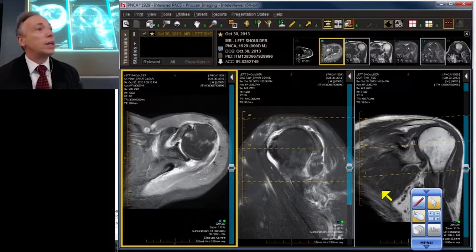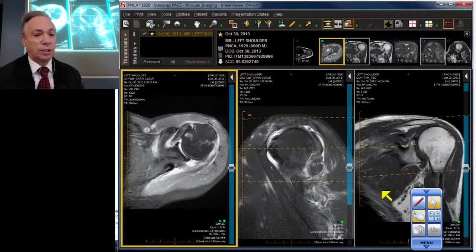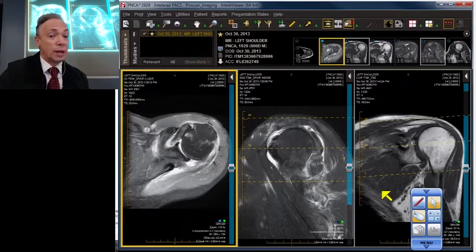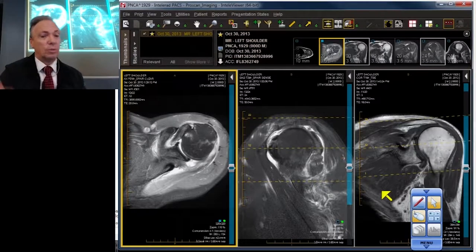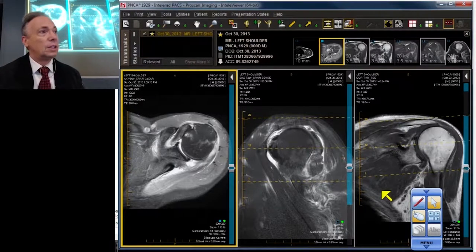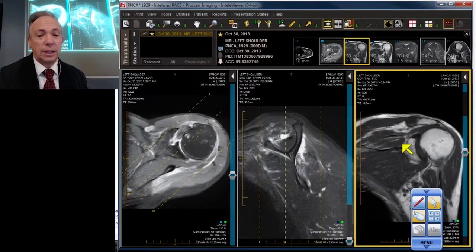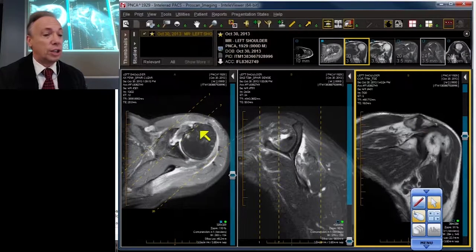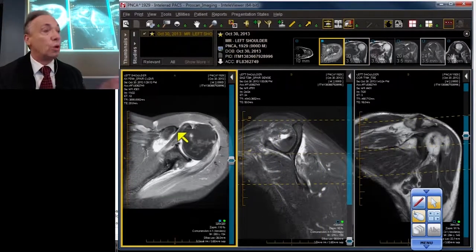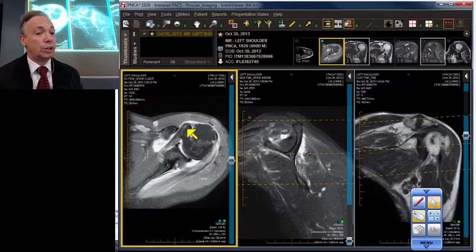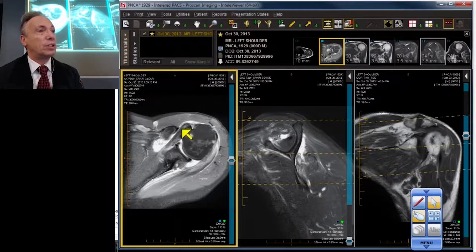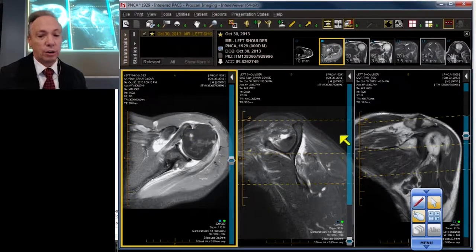We've been talking about the rotator cuff and its six major components: supraspinatus, infraspinatus, teres minor, subscapularis, coracohumeral ligament, and capsule. We've also been talking about the arches — the lateral arch underneath the acromion, the medial arch underneath the AC joint, and the subcoracoid or anterior arch, which can damage or injure the lesser tuberosity, the biceps, and the subscapularis — the forgotten arch.